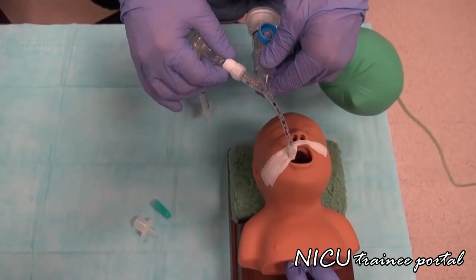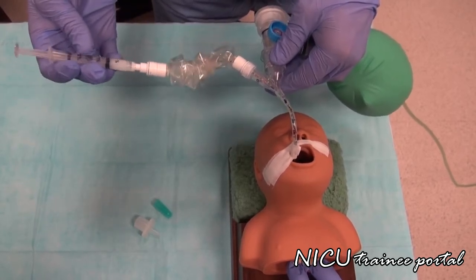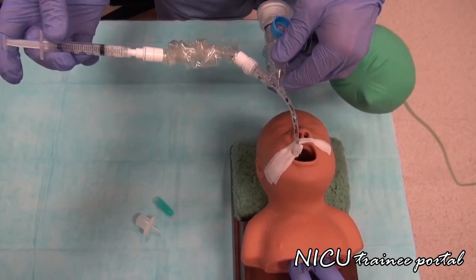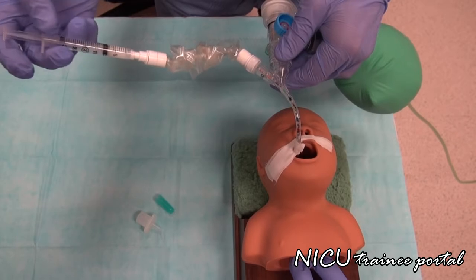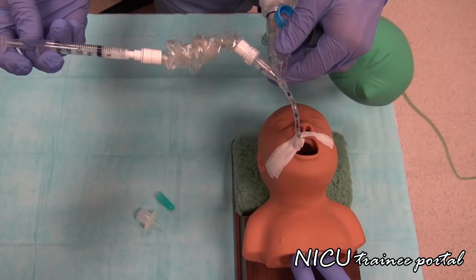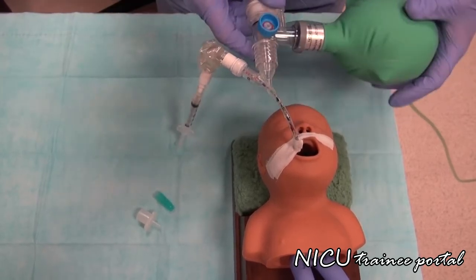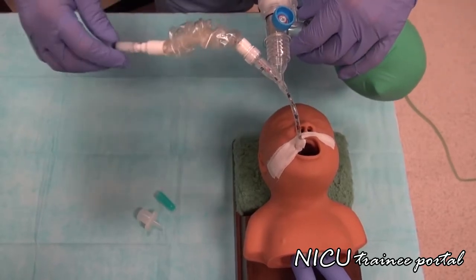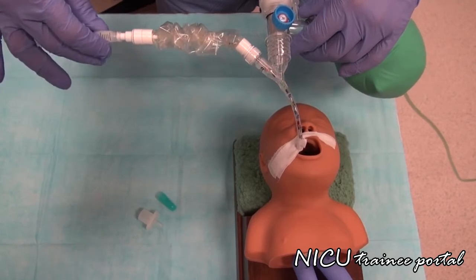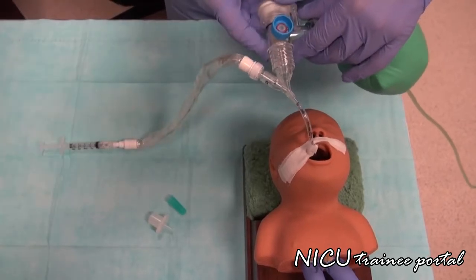From there, we will then take our aliquot, or our dose of surfactant. We will administer that over a period of a few seconds, ensuring that the surfactant does not come back up the tube, and if it does, we will just continue to bag the patient through that procedure. And as you finish administering the dose of surfactant, remove the catheter and then resume normal bagging.